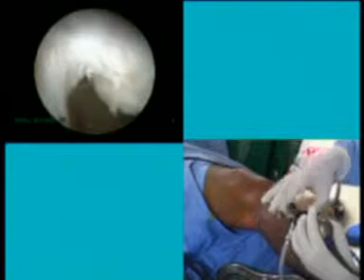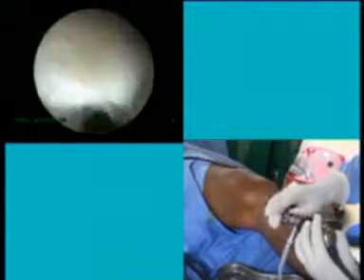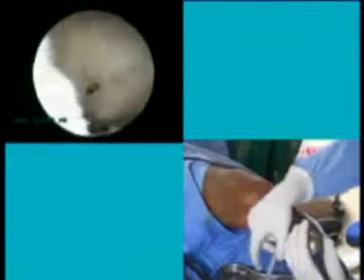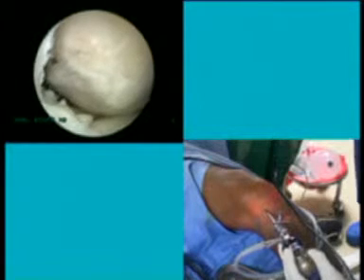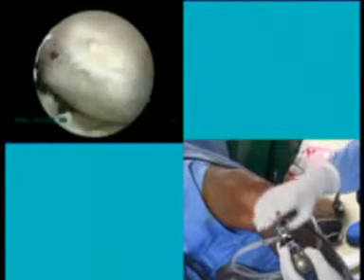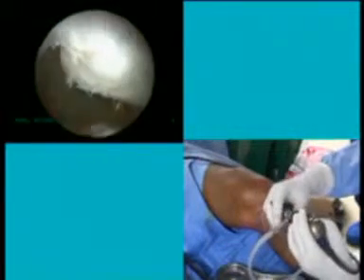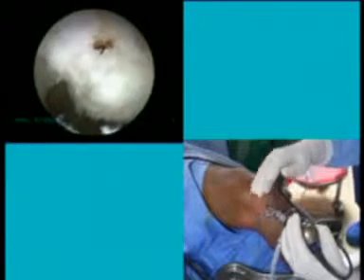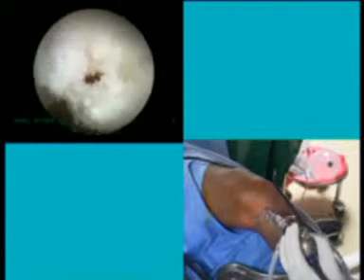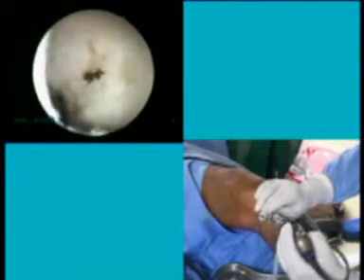here you can see the landmarks. One landmark for orientation at the femoral side is the intercondylar line here, and then the cartilage border, which is here. Maybe you can recognize the old remnants of the ACL. Yes, a quite oval insertion. It ended here. Here is the PL area, and here the AM. And as I told you in the cadaver course already, at the transition between the intercondylar line and the cartilage border, there's a transition between AM insertion and PL insertion. Okay. So I'm quite happy with this position.